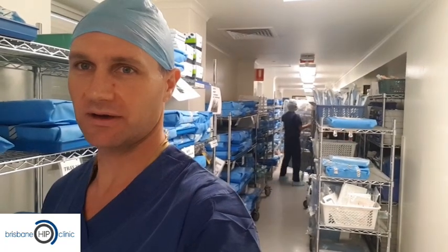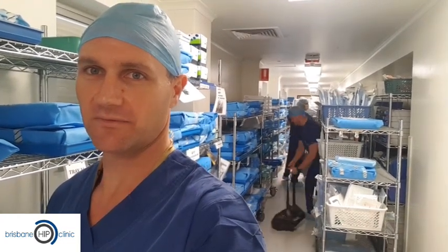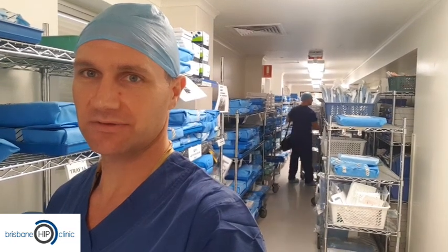This is the behind-the-theatres zone and this is where we keep all our instruments and implants for our joint replacement surgeries. I'm going to take you through and show you some of the tools that we have at our disposal to be able to do your joint replacement in a customised way.